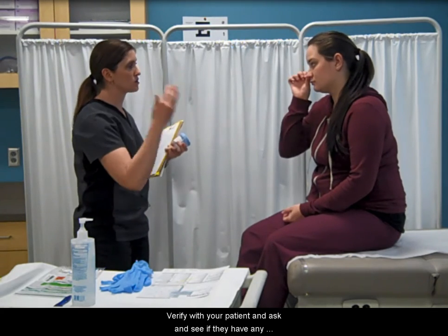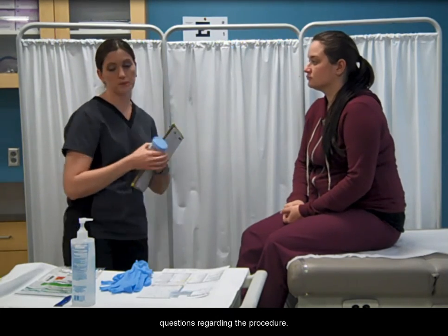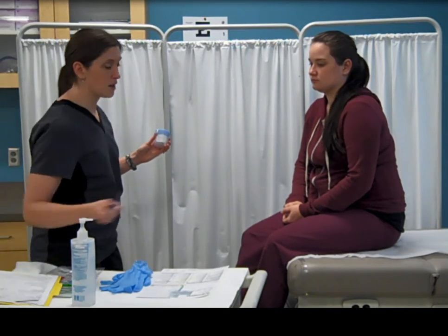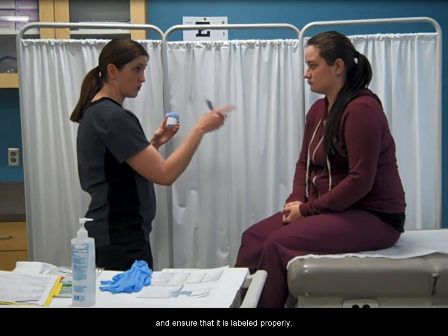Verify with your patient and ask if they have any questions regarding the procedure. Show them the cup and ensure that it is labeled properly.